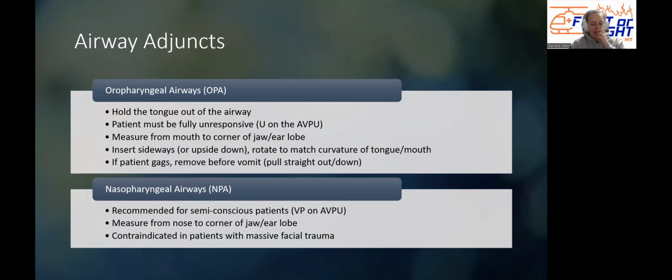And basically what I found is that whichever way you go, there's a part of the nose that could potentially bleed. So my takeaway from that: make sure that when you're putting these in, you do it gently. Make sure you put lubrication onto the NPA before you insert it. And then as you go, just kind of go slow. And if you feel any resistance, do not force beyond that point of resistance. So that's going to be the best way to prevent bleeding, no matter which way you insert it.